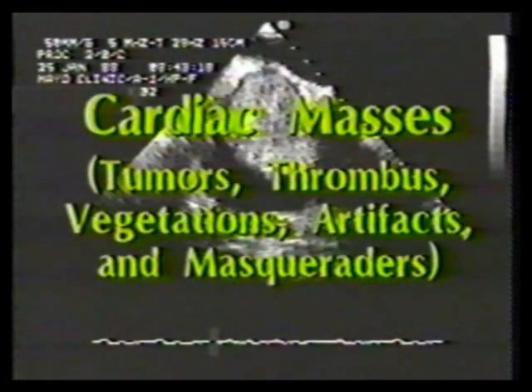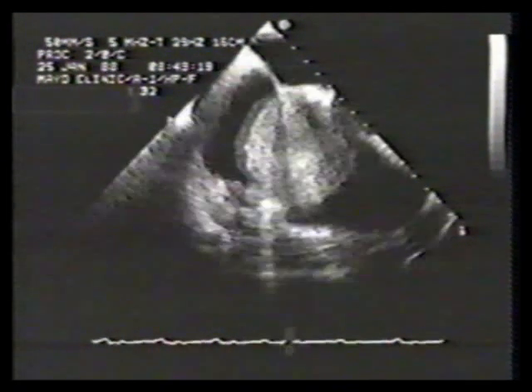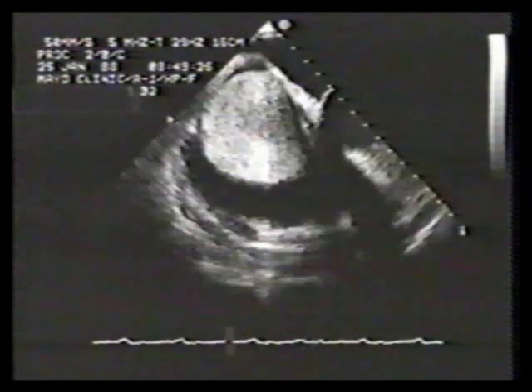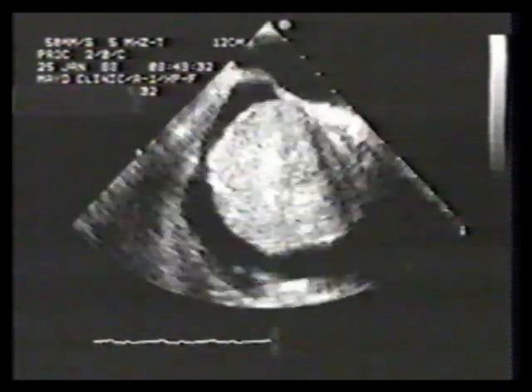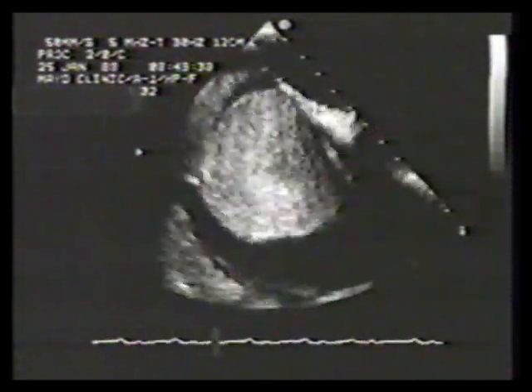In the 1960s, M-mode echocardiography first permitted non-invasive diagnosis of some cavitary tumors, in particular the atrial myxoma. However, this technique did not appreciably impact on the necessity for confirmatory cardiac catheterization. In the 1980s, two-dimensional echocardiography, and more recently transesophageal echocardiography, as illustrated in this example, have become the imaging procedures of choice and a substitute for conventional angiography in most circumstances.